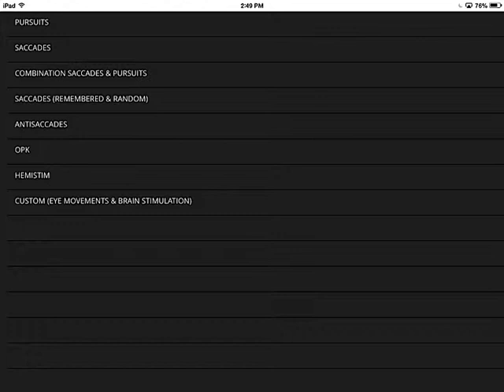I'm going to go through the pursuit saccades, combination saccades, and pursuit exercises in the new Focus Builder. We completely redesigned the application and improved it significantly by adding a lot more customizability.